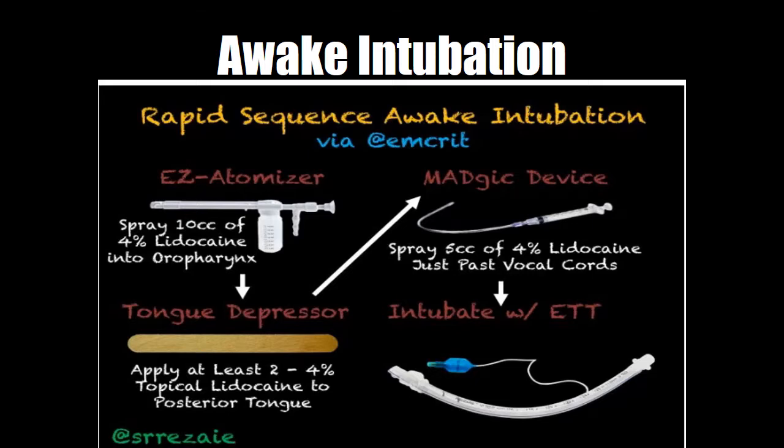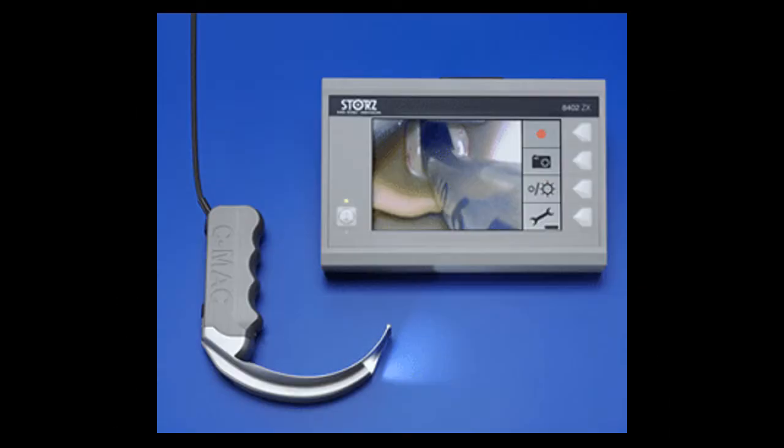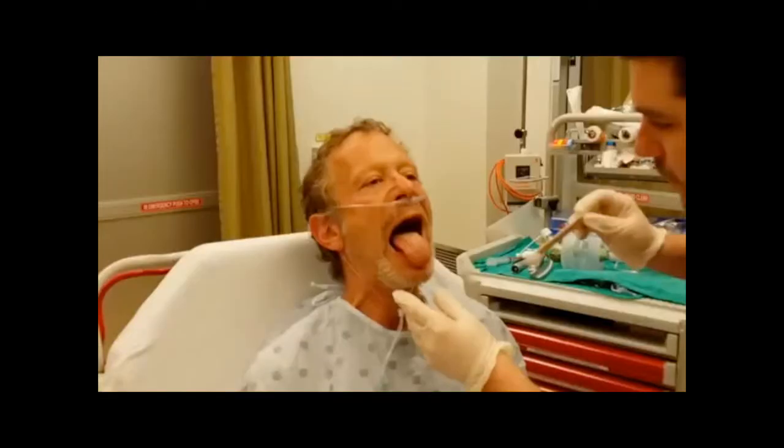So doing it with standard laryngoscopy, you can either use the standard C-MAC blade or you can use the D blade. If you're using the D blade, then the view of the cords is only going to be on the monitor. I would advocate that the D blade is a really useful tool, but the problem with the D blade, not just for awake intubations, but for RSIs as well, is that the view is often very good, but the intubation is difficult. So in our easier emergency intubations, why don't we start playing with the D blade so that we get used to intubating easy airways before we're confronted with a difficult airway that we're then going to struggle to intubate. Anyway, here is a video for you to watch of, so this is George Kovacs of the AIM Airway.